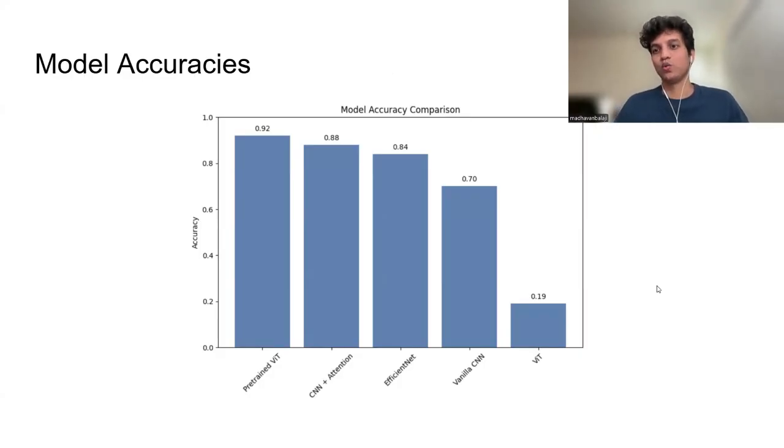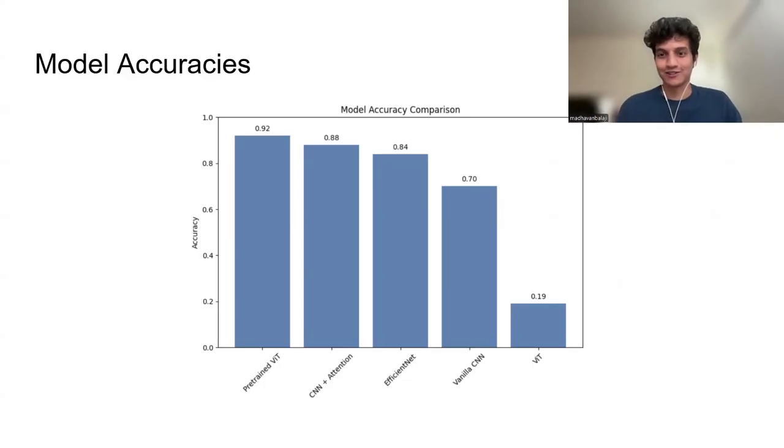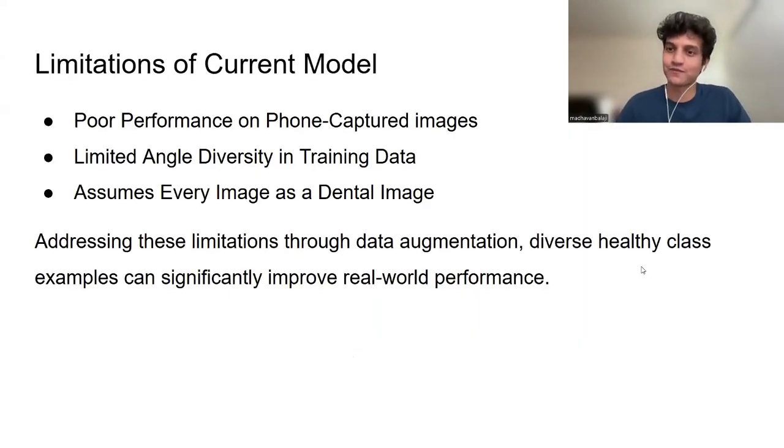So what we did is data augmentation. We did data augmentation by 10 folds. From 15,000 images, we data augmented into 150,000 images. We converted, and then we could get like 10% accuracy. And then the overall accuracy, which is like 19%, is what we could achieve. This is not very good, so we are not going to talk about this model now. Next image.